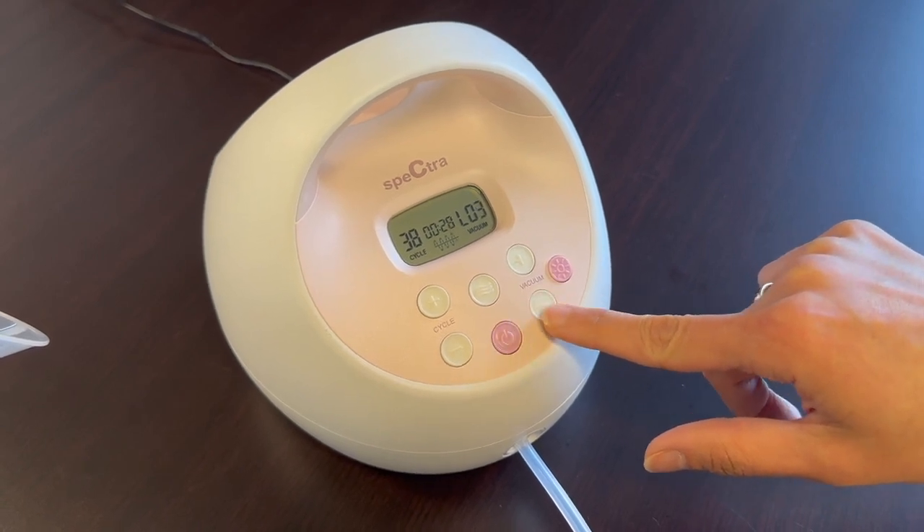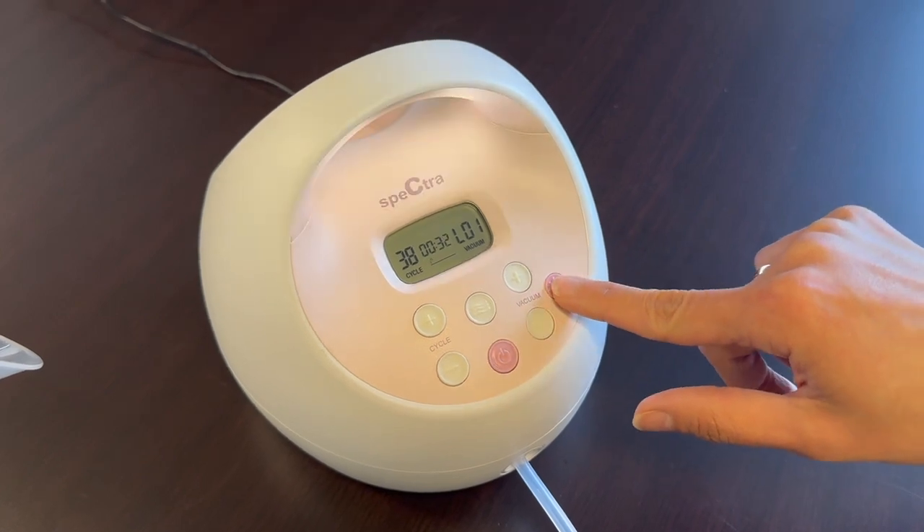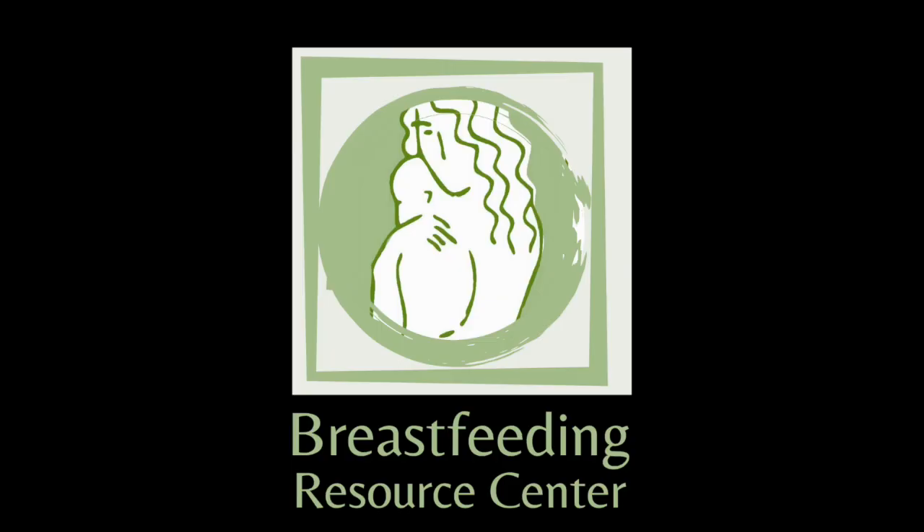When finished, wash the pump parts separately with hot soapy water, rinse, and let them air dry.